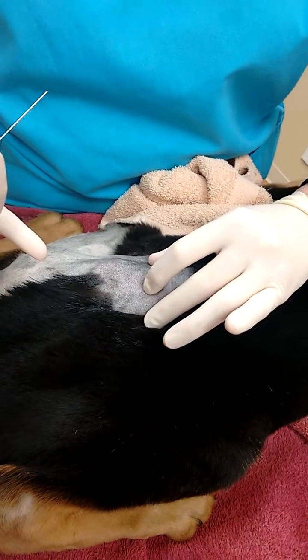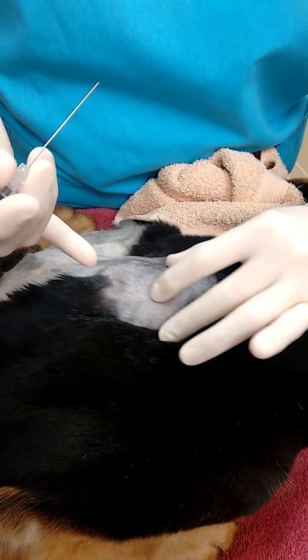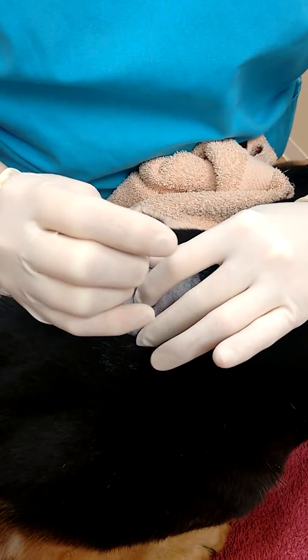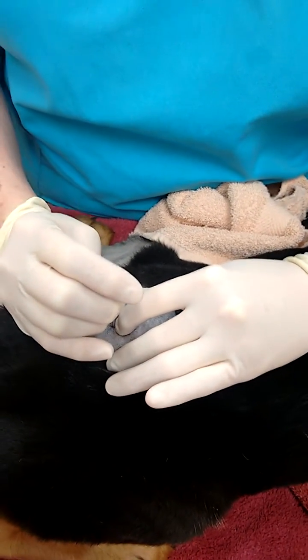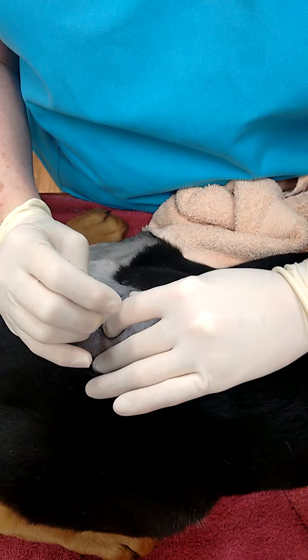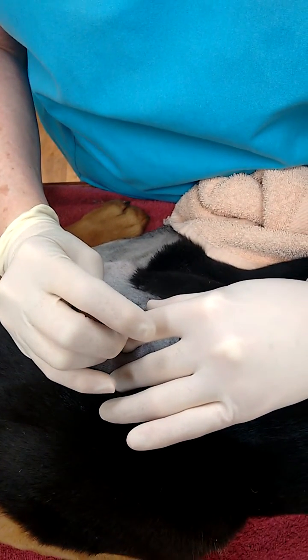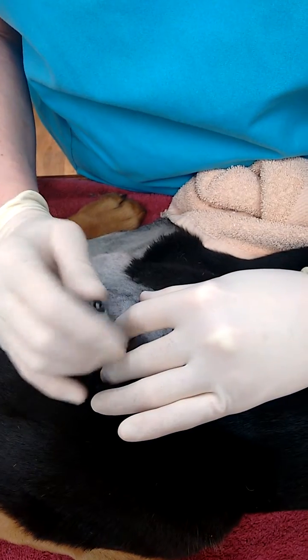You can feel it in between that process right here and this process here. And you're going to go straight in at your point and straight through. You may have to reposition because he's just so... Until there we go.